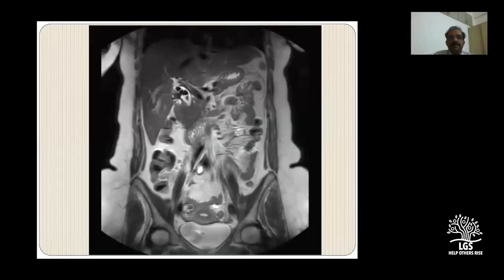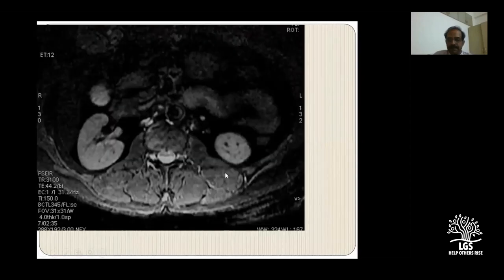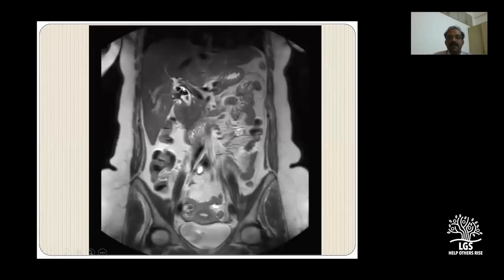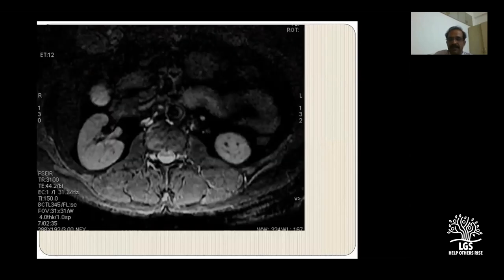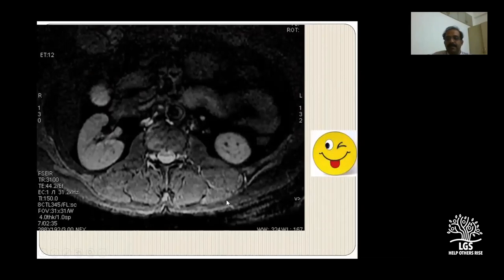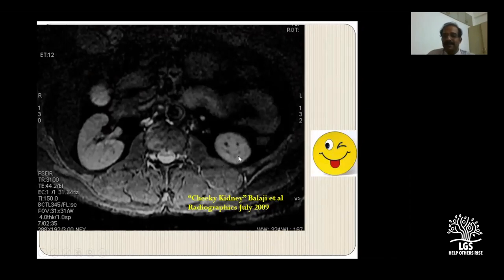Coming to the end - this was the same choledochal cyst case with calculi. We found something like a smiling kidney here and published it in one of the radiology journals - you can see two eyes - a fun aspect of radiology. Thanks for your patient listening.